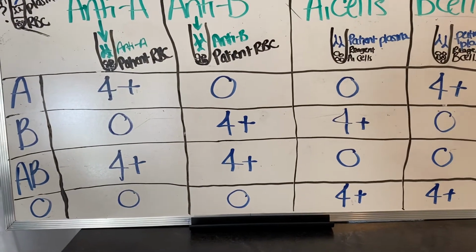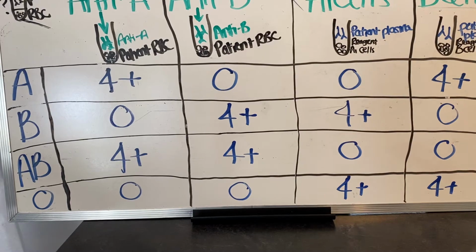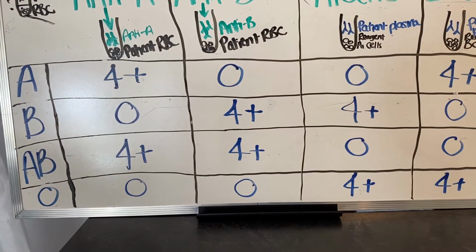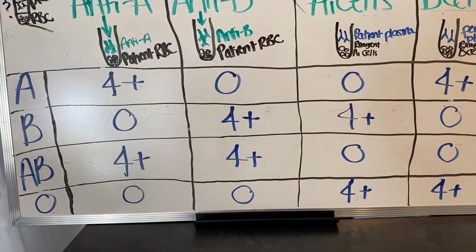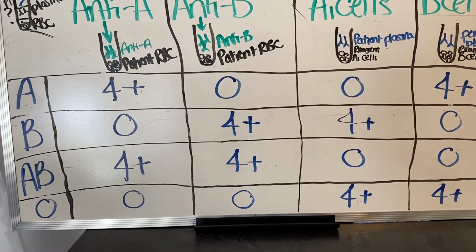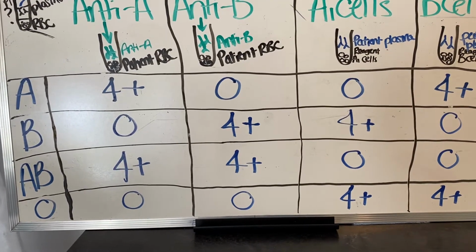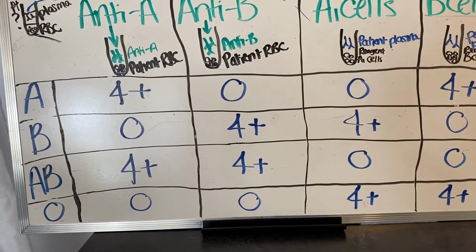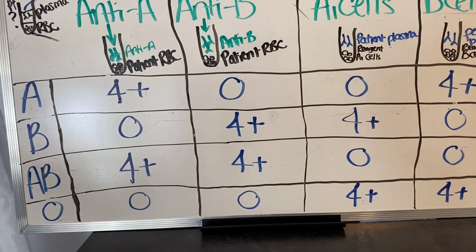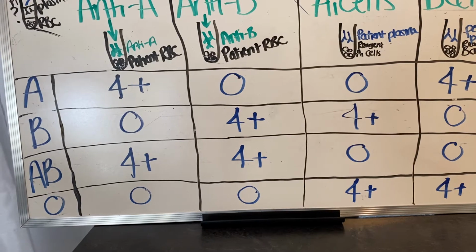The only thing we do for group O is, by a process of elimination, if they didn't react with anti-A and they didn't react with anti-B, that must mean that they do not have any AB antigens on the red cell surface and they're group O. If they truly are a Bombay individual, they will have a lack of that H antigen. They only have the precursor substance. They weren't able to convert their precursor into the H antigen, which means they could not possibly have A or B antigens or the H antigen on their red cell surface. And so by nature of that, if they are Bombay and they lack all of those antigens, they will have naturally occurring anti-A, anti-B, and anti-H in their plasma. Nobody in this world has anti-H unless you are Bombay.